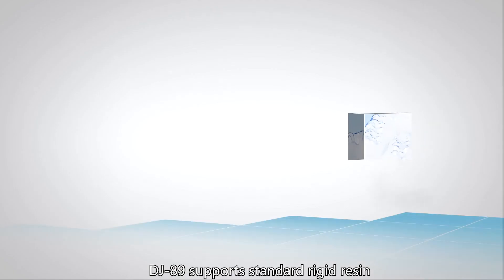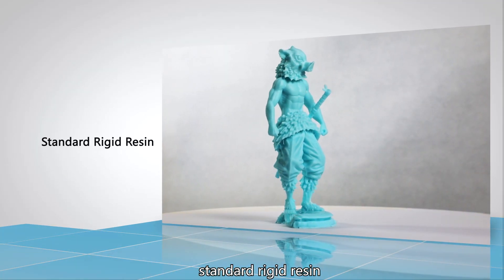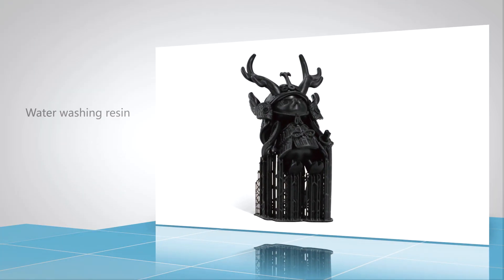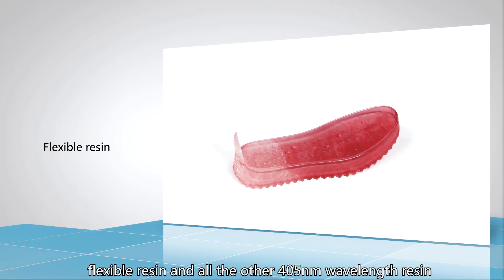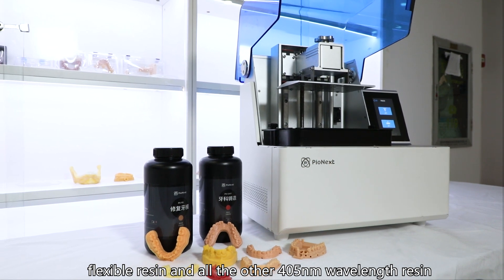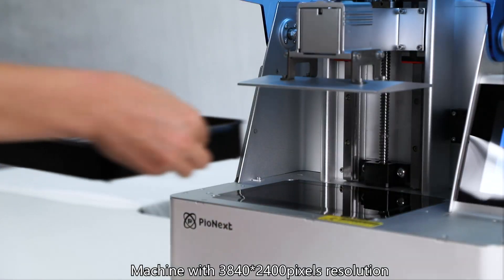The DJ89 supports orthodontic resin, standard rigid resin, high-transparency resin, water washing resin, ABS resin, flexible resin, and all other 405 nm wavelength resins. The machine is also compatible with third-party resins.